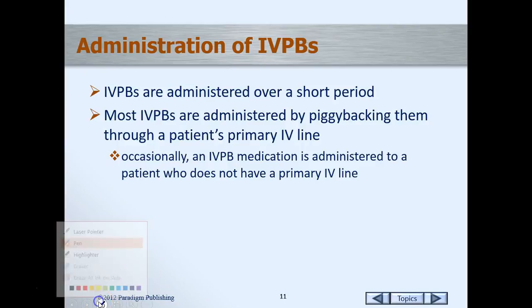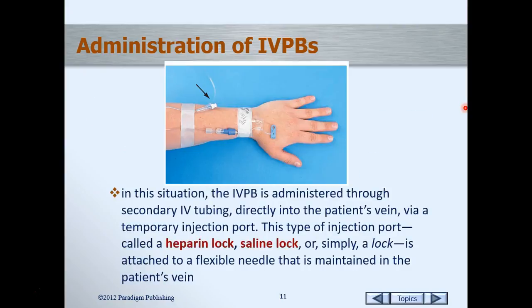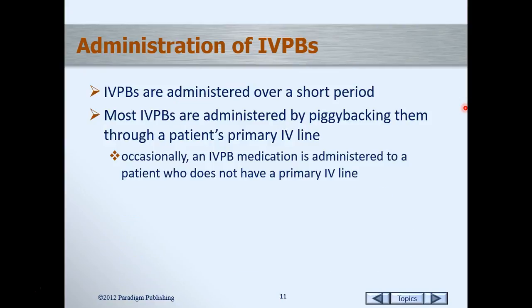Most piggybacks are given over a short period of time. They're administered through the primary line. Occasionally, a piggyback is administered. Why that was repeated, I have no idea. All right. Well, let's go back. So it's administered through the primary line.